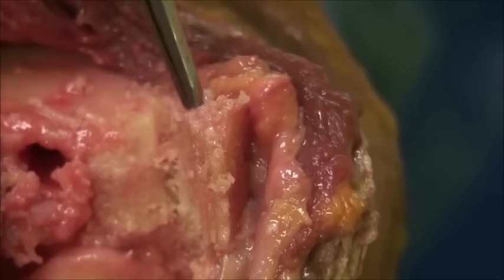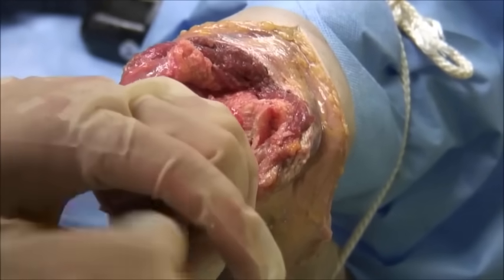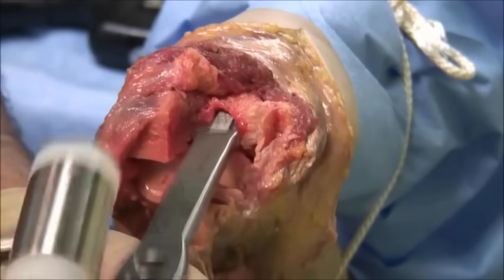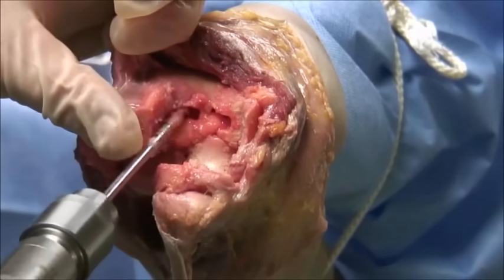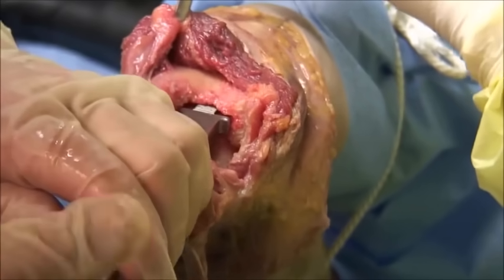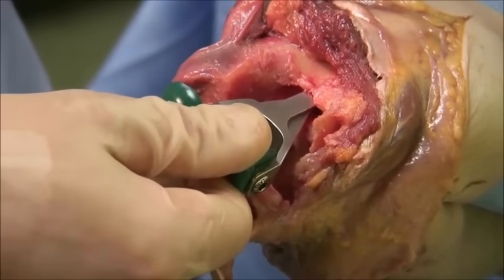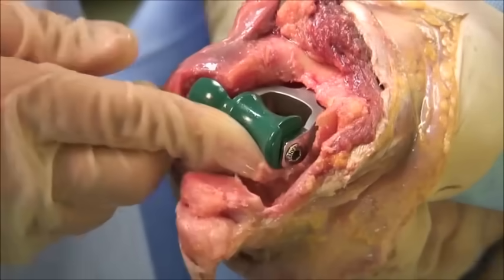The drilled holes mark the resection. Using the power rasps, the right size of implant is determined. To prevent intraoperative fractures, a cannulated reamer over a previously intramedullary inserted K-wire can be used instead of the broaches. Trial components can then be inserted, here with the green articular surface which relates to the posterior offset as determined previously.